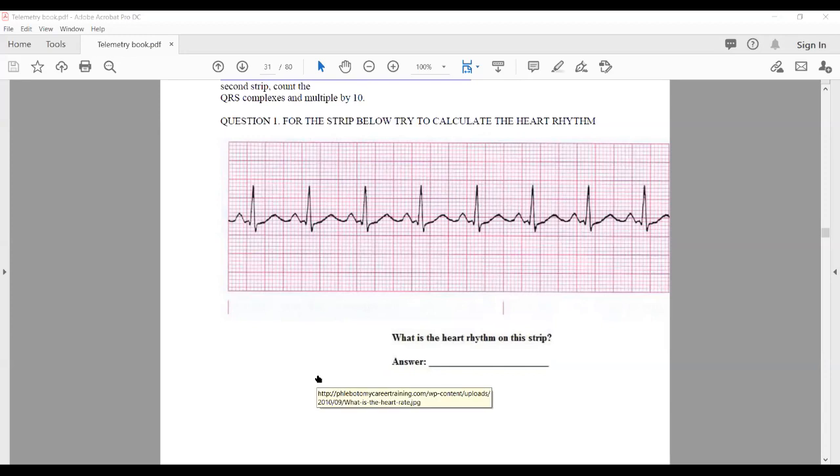We've just measured heart rate, so give yourselves a gold star because that can be kind of confounding. If you understand it so far, you're doing amazing. Now let's go ahead and get some measurements while we're looking at this strip. I'm going to see if I can find my screen calipers. These guys are kind of cool. Okay, here's my screen calipers. I'm going to bring these guys up.